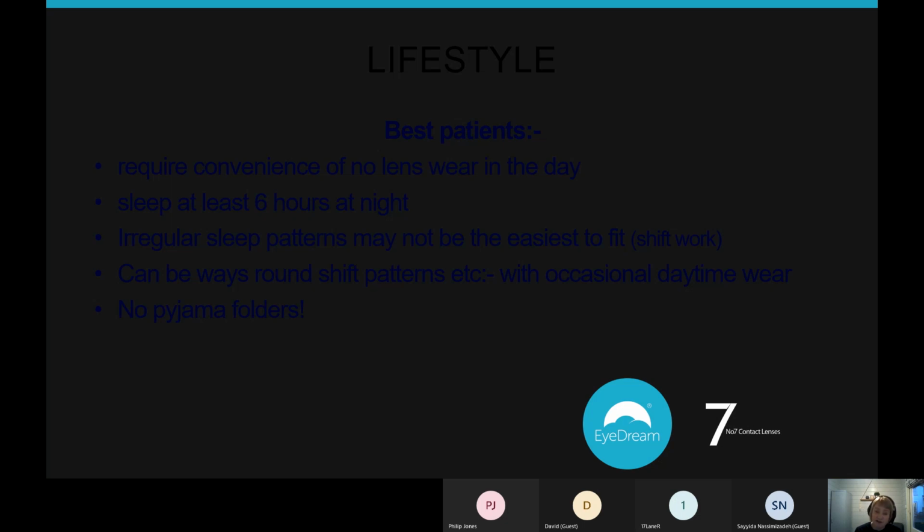You'll remember from the theory presentations that the lens is flat in the center to the extent of the patient's prescription. So therefore there's a tear lens behind that lens, which will always be correcting the prescription, so they can always see with the lenses in. So top-up daytime wear will give them good vision.